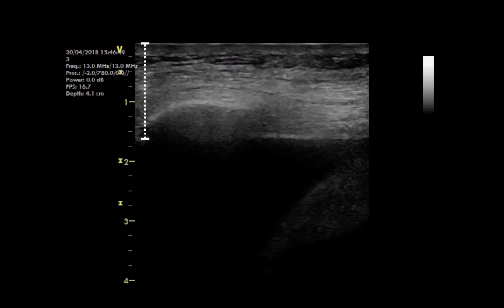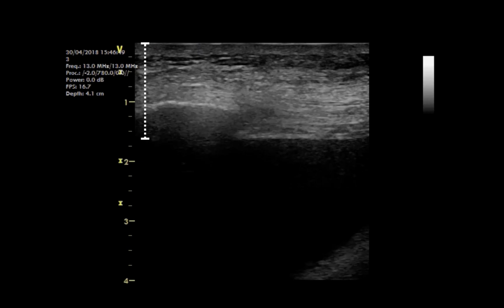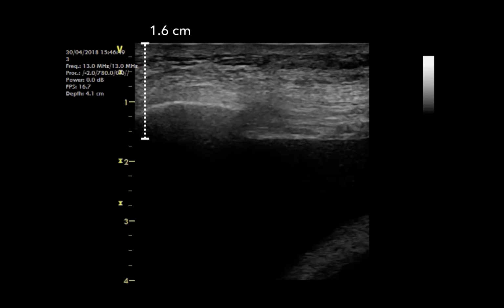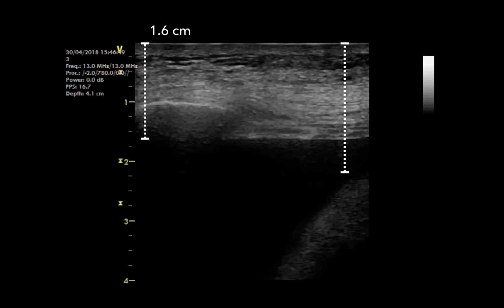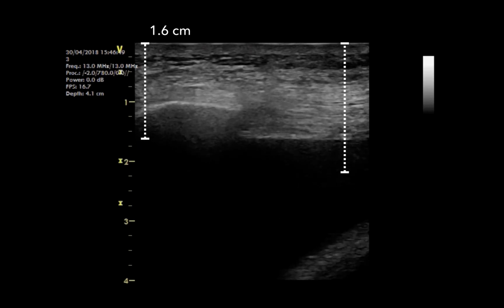In this clip, you can measure the minimal depth of penetration you will have to go through with your needle. That represents the soft tissues until you reach the pleura. The measure on the right represents the maximal depth that you will insert the needle, at which point you are likely to hit the lung that is floating up to the pleura.